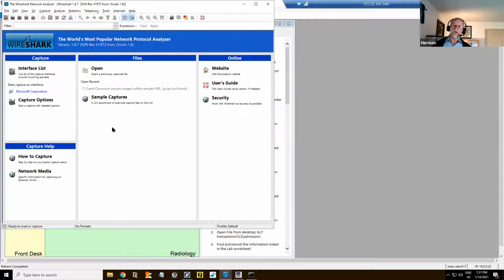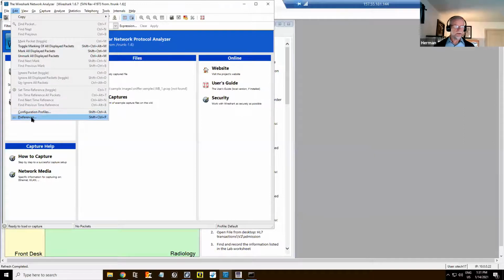So what did I tell you? When we set up Wireshark, we have to do 3 things: set up the preferences, start the capture, and do the filter. So how do we set up the preferences? Very easy. There's Edit, Preferences.